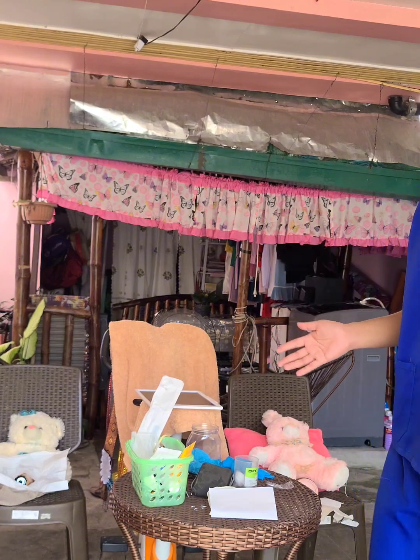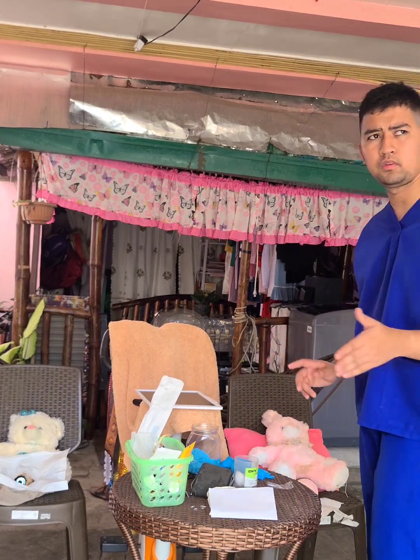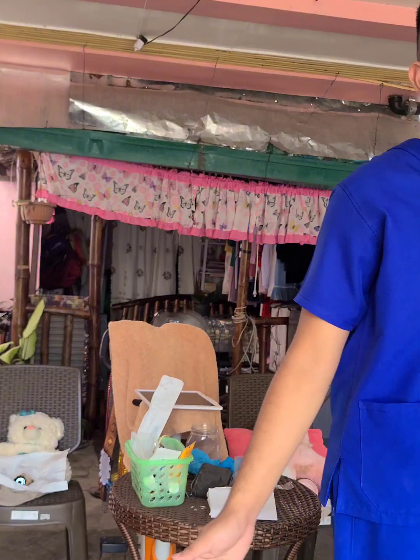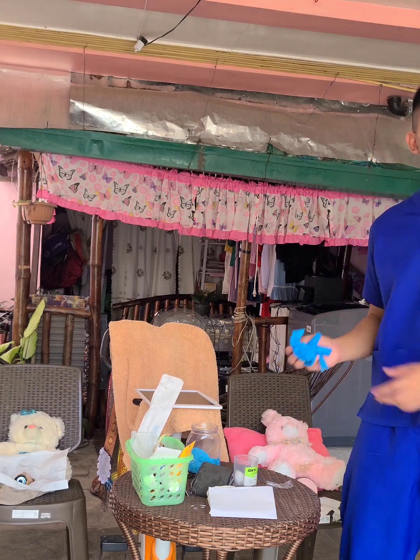So now we're going to provide an adequate amount of lighting, and then we're going to provide privacy to our patient. So assuming this is a closed door, we're going to close all the curtains and then close the door. Then after providing privacy to the patient, we're going to don our clean gloves.